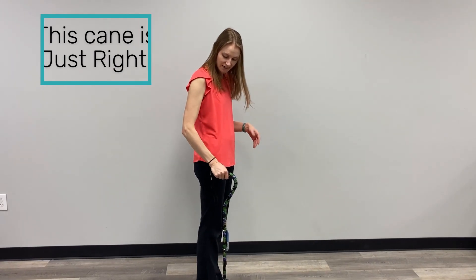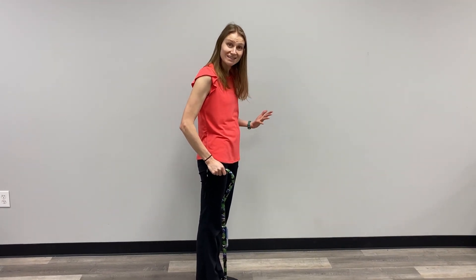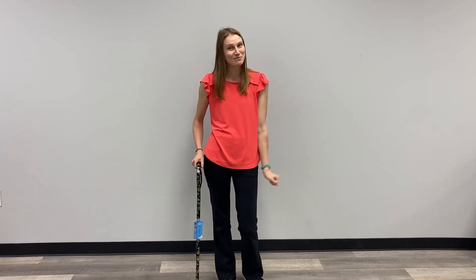If I give it a try and hold tight, I have that nice natural bend in my elbow that is great for joint protection. I can walk with my back nice and straight, and this is how I know that my cane is at the right height for me. You may have to make some adjustments one notch higher or one notch lower to see what works for you, but this is a great starting place to make sure that when you're using your cane, you are walking with optimal posture as you go about your day.